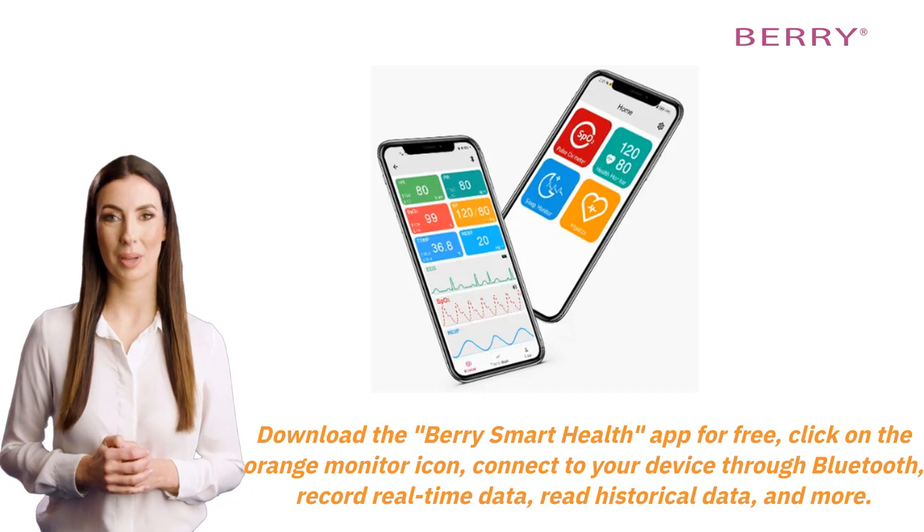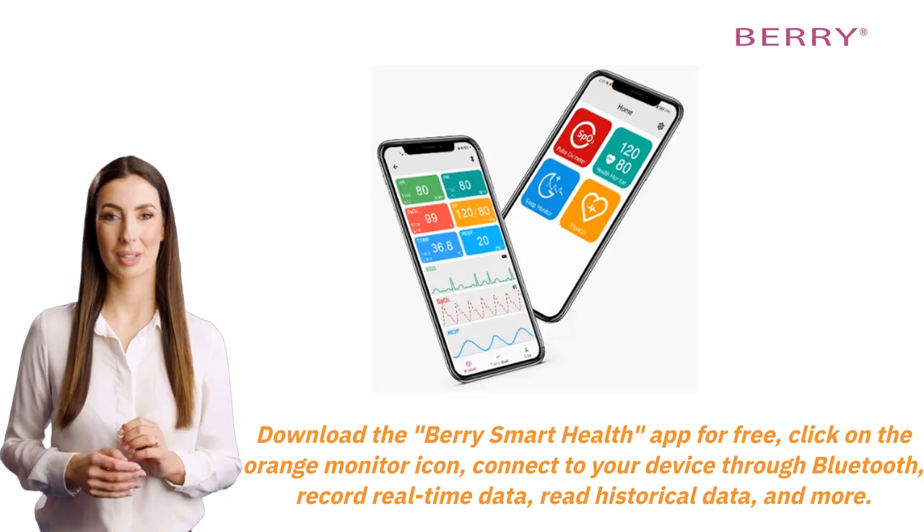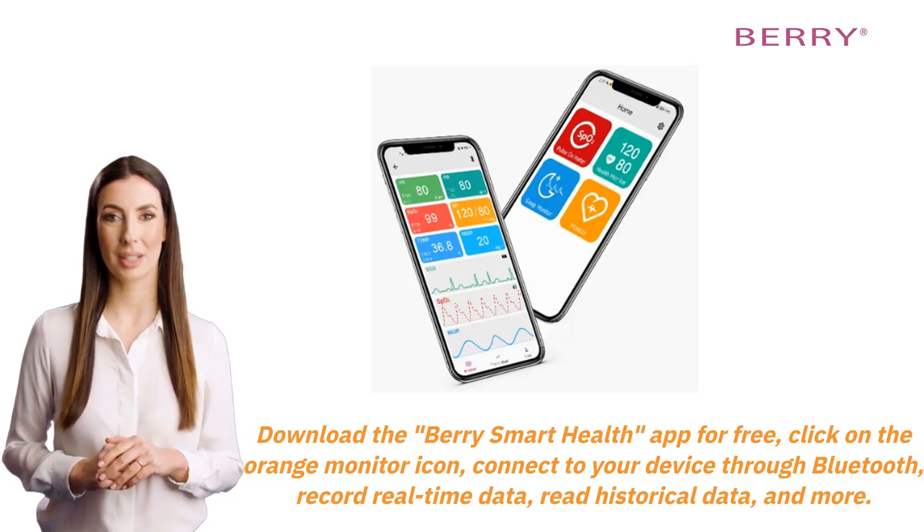Download the Berry Smart Health app for free. Click on the orange monitor icon and connect to your device through Bluetooth to record real-time data, read historical data, and more.